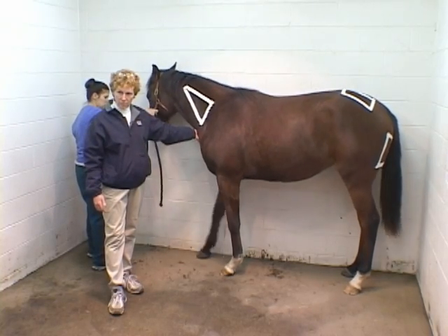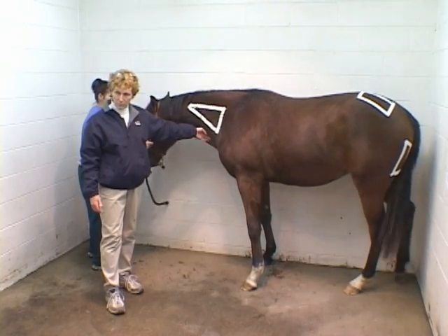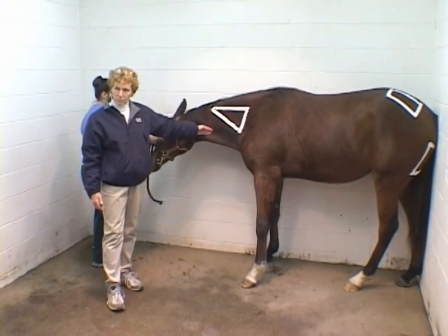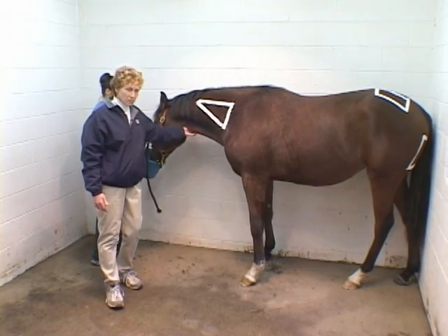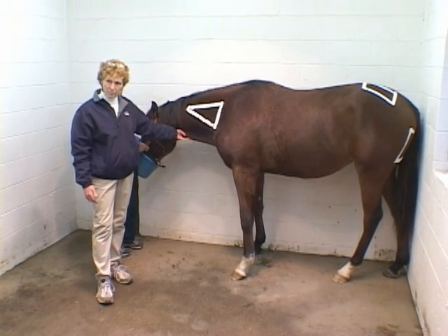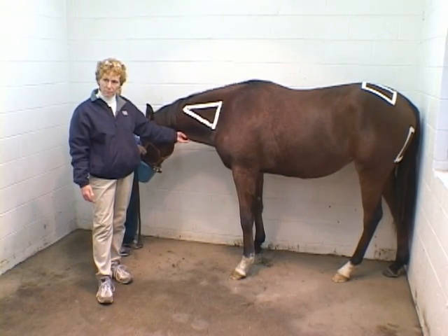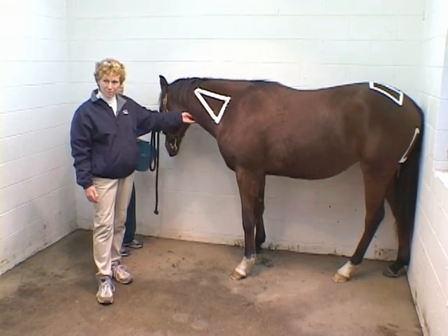I probably put 90% of my injections into the neck. Most of what we do — we do a lot of vaccinating — and that's where we'll put a lot of vaccinations. Certainly, as you mentioned, back there at the semimembranosus and semitendinosus, especially on a yearling like this, it's pretty light on her feet — that wouldn't be your favorite place to go.